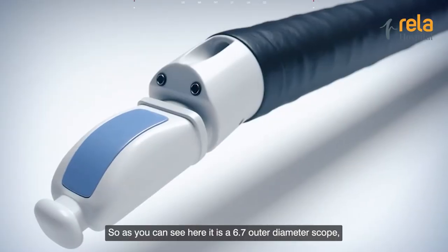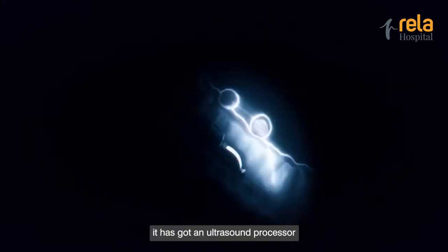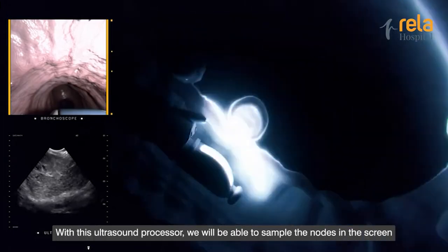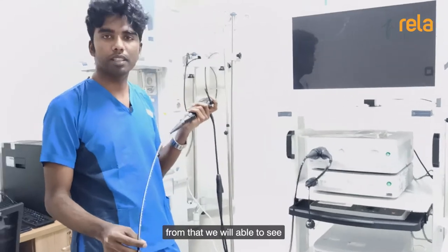As you can see here, it is a 6.7 outer diameter scope. It has got an ultrasound processor. With this, it has a scanning range of around 35 to 80 degrees. With this ultrasound processor, we will be able to sample the nodes on the screen.